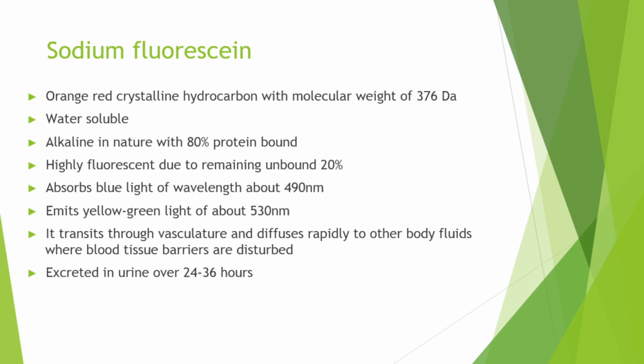It absorbs blue light of wavelength about 465 to 490 nanometers and emits a yellow-green light of 530 nanometers. It diffuses rapidly to other body fluids due to its low molecular weight and high water solubility. It is excreted in urine over 24 to 36 hours.